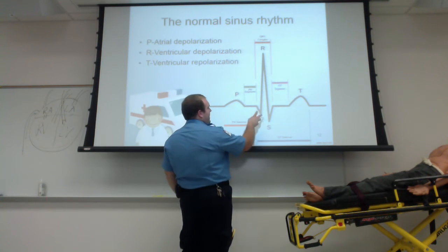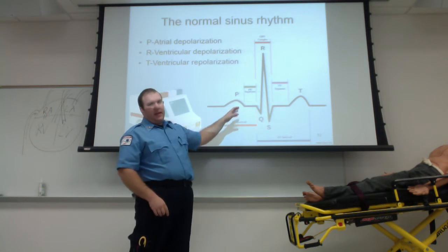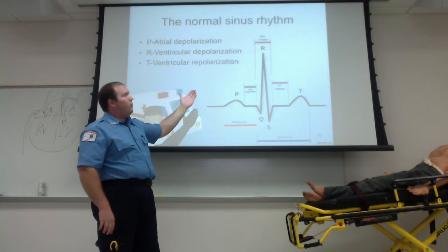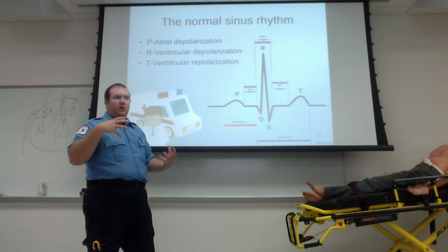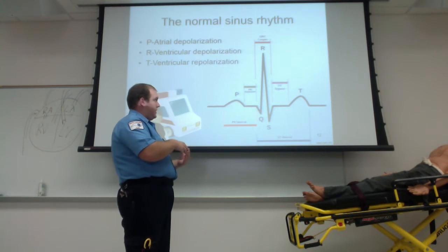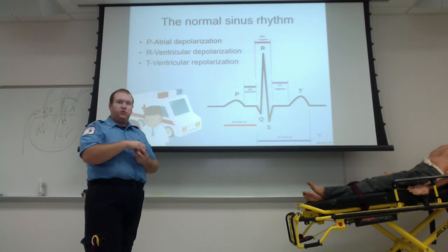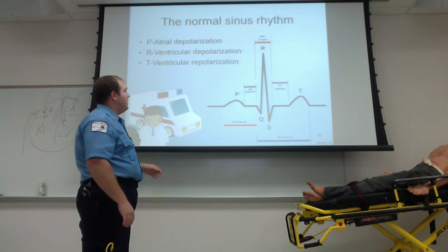This is the main portion of whenever you feel your pulse. This is what you're feeling happen, the main portion of this being your R wave. The R wave is when the action potential is given to your ventricles, and your ventricles contract and squeeze, depolarize in other words.